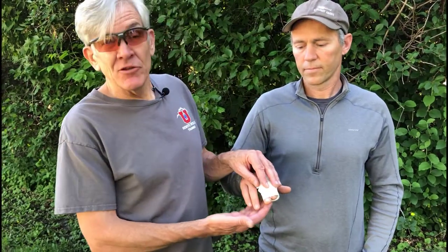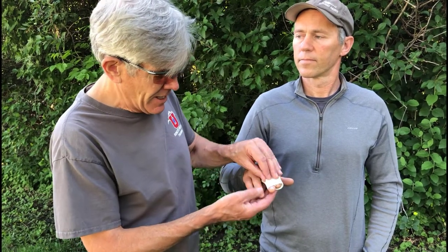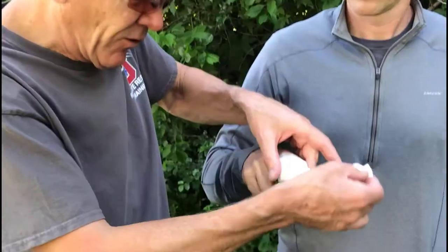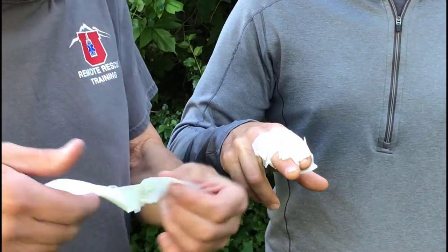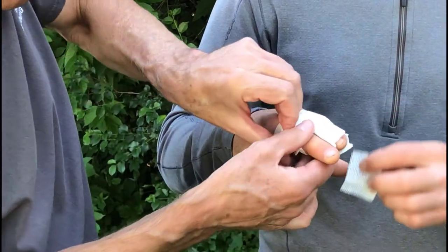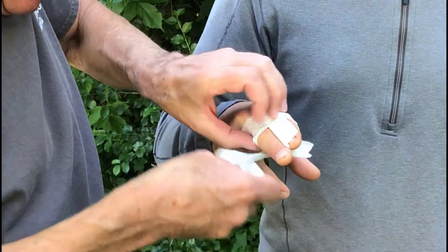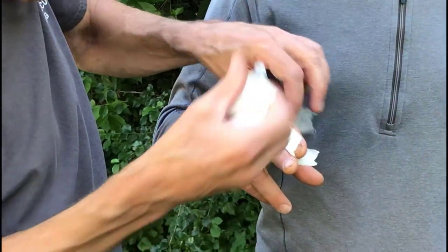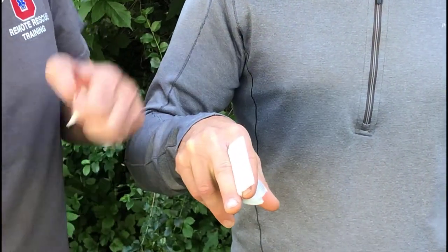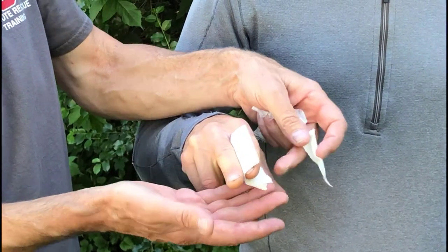Another example of using the body to gain rigidity through buddy splinting is a finger injury. I've avoided having any tape against the skin by using just a thin piece of gauze where the tape was going. Very importantly, put some gauze between the fingers — we don't want skin-to-skin contact that could damage the skin.